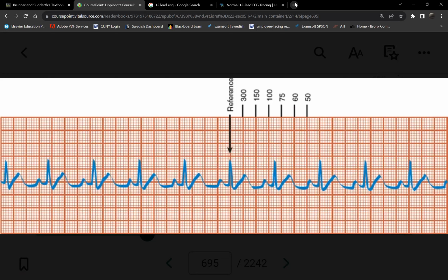It's going to be a little difficult if the rhythm is irregular. However, do not worry, because if it's an irregular rhythm, will the heart rate be the same from 1 minute to the next minute? It won't be the same anyway, correct? So it's still going to be an estimate. Are we clear? And don't worry, as long as you have working equipment, the monitor machine will give you an estimated heart rate. You don't have to count it.